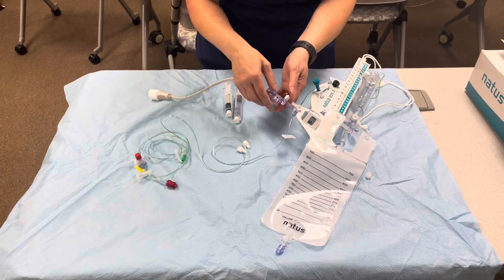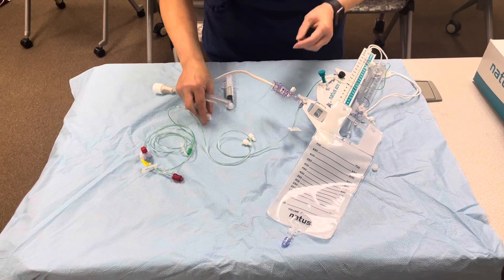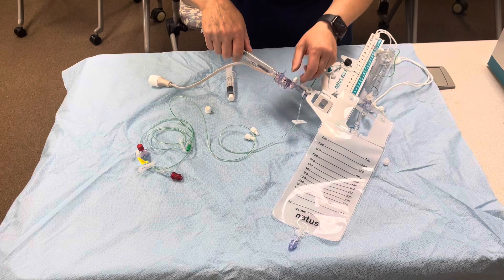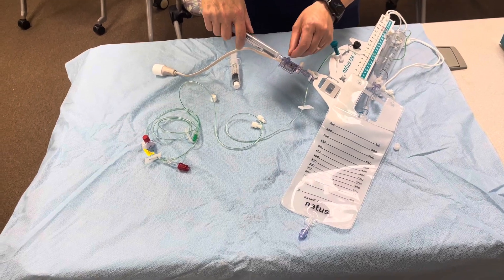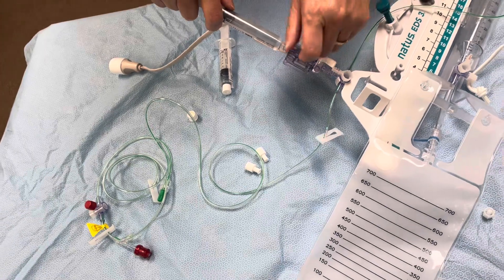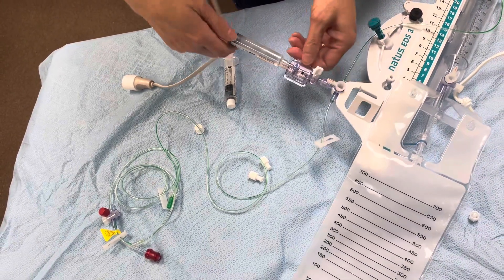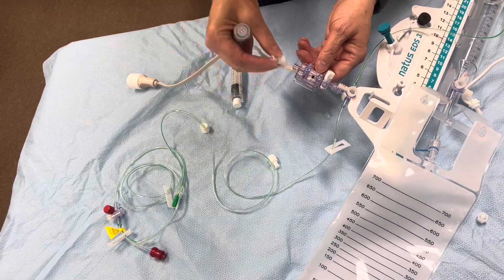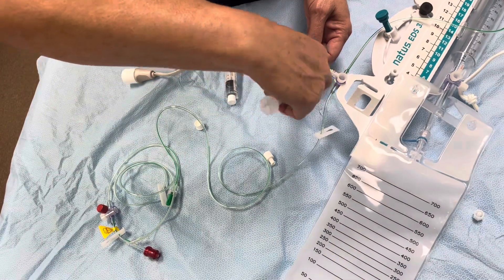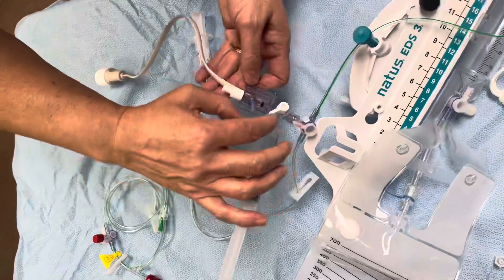We are going to prime it, starting from the transducer piece. By closing — as you see here — I'm going to go ahead and close the end cap because I don't want to use it, and switch to this piece and close off to the transducer.